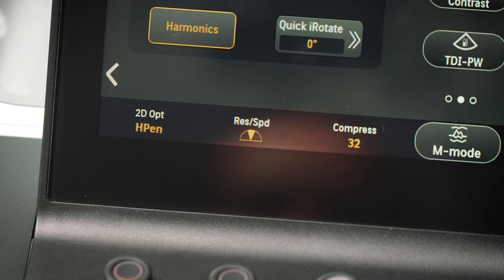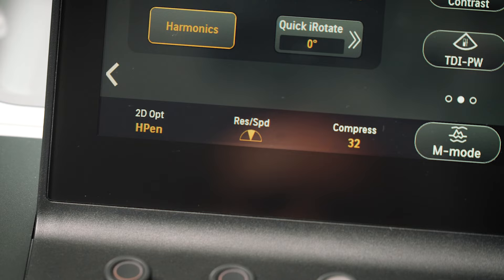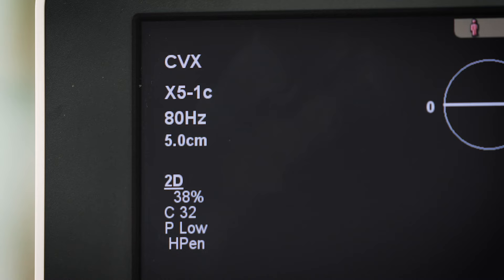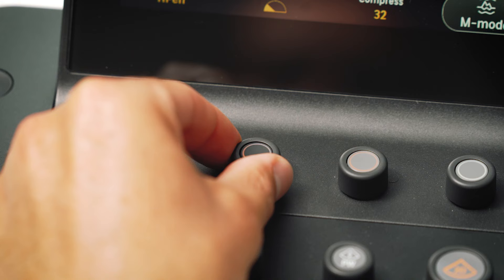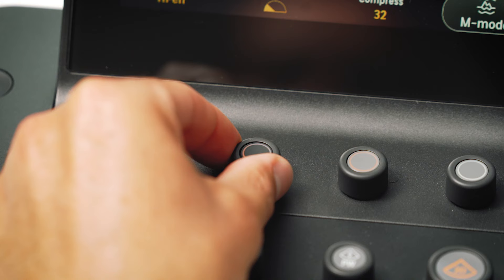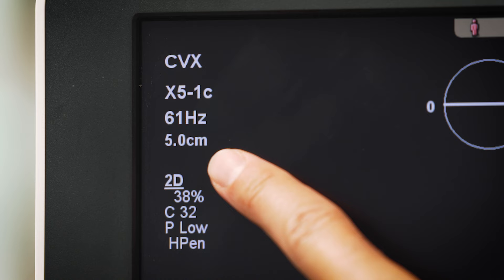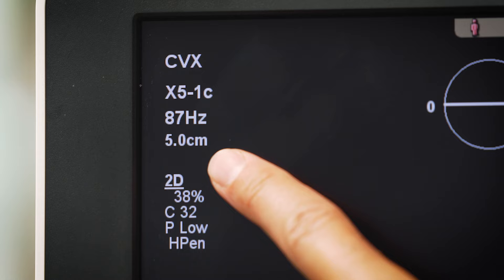The resolution/speed rotary key provides optimization of temporal versus lateral resolution. Moving towards resolution increases the lateral resolution and reduces the frame rate. Rotating the dial towards speed progressively increases the frame rate and lowers the lateral resolution.